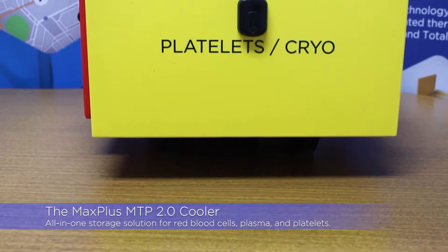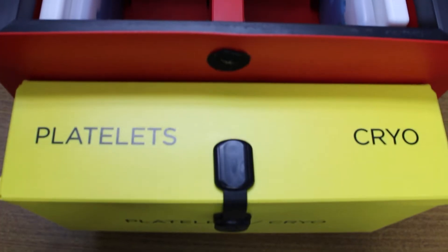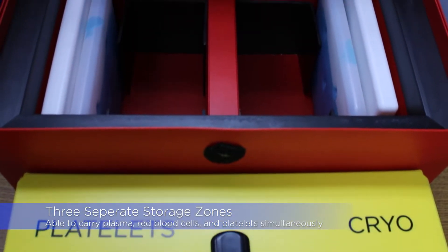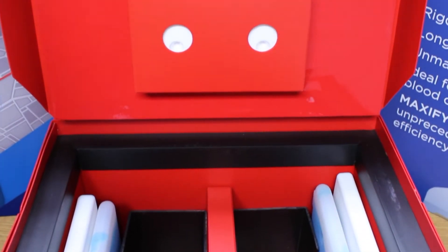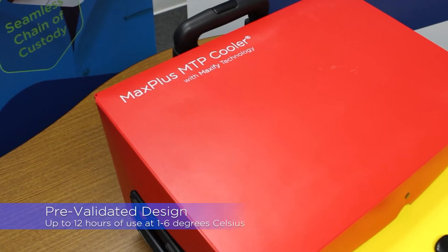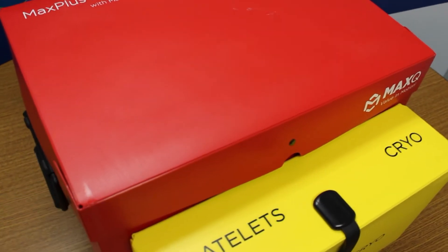The Max Plus MTP 2.0 cooler is our newest cooler with three separate temperature zones to store red blood cells, cold or warm plasma, and room temperature platelets. The MTP 2.0 cooler is pre-validated for up to 12 hours of use at 1 to 6 degrees Celsius.